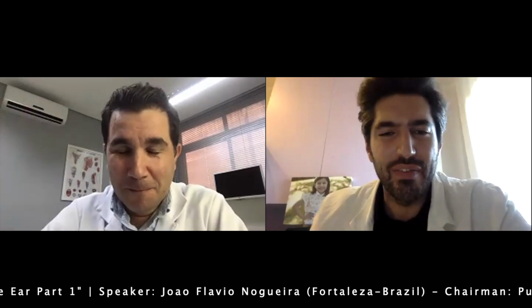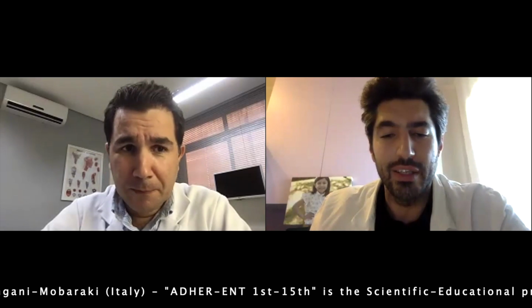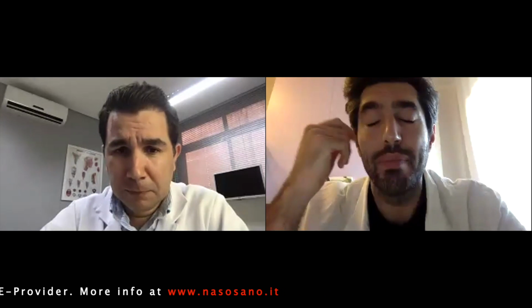So we decided very quickly to add this panel because it's very important for us to have educational training, and not only single cases, but also educational and teaching material for providing the exact field of each of the ENT panorama. And regarding that, we decided to have also some anatomical dissection. And today, Joao is going to provide us some indication regarding the middle ear anatomy and how to reach with the endoscopic approach inside of the middle ear.